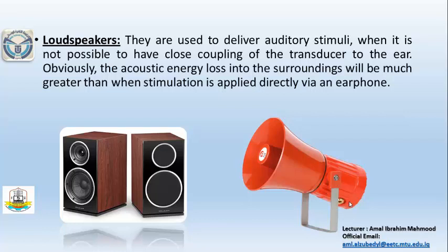Now, we'll discuss the loudspeaker. Loudspeakers are used to deliver auditory stimuli when it is not possible to have a close coupling of the transducer to the ear. Obviously, the acoustic energy loss into the surroundings will be much greater than when stimulation is applied via the earphone.